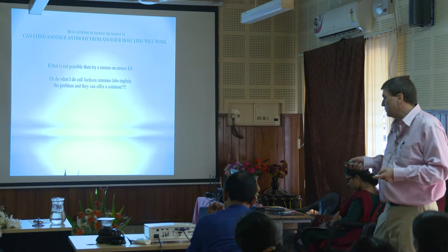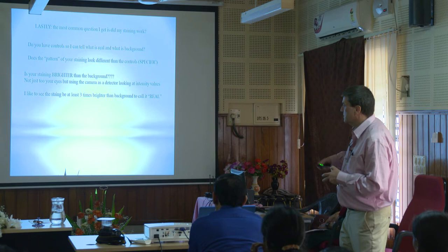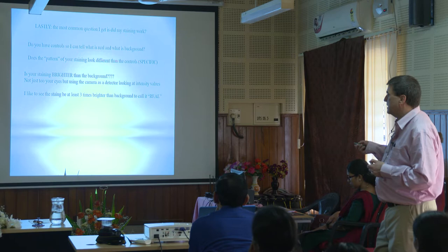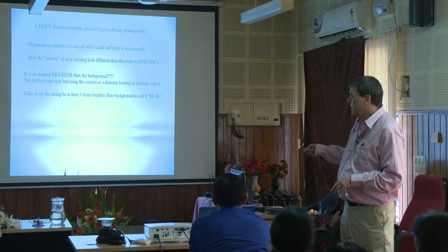Okay, and like I said, lastly, the most common question I always get is, did my staining work? So a couple other little things about it. Let's say the controls look good. The thing to keep in mind about antibody staining is, is the pattern different? Does the pattern you see in the tissue, the staining itself, look different than the other controls? It should. The staining that works should give you a different pattern.